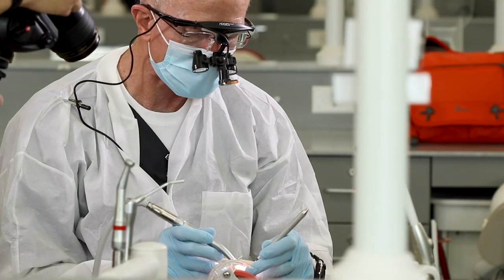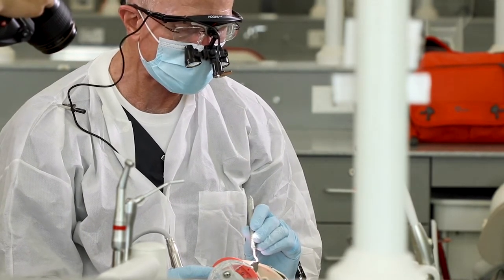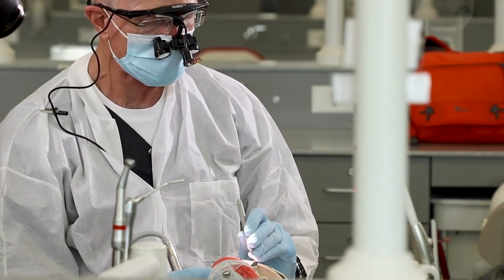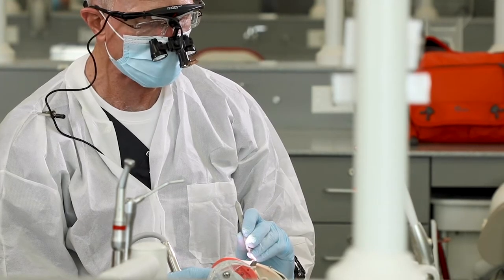This oblique ridge on these upper molars has quite a difference in height — there's quite a step down usually to get to that distal lingual cusp. We want to be a little careful not to over-reduce on the distal because we're trying to be conservative of our tooth structure. Getting closer now — I need to do a better job of mirroring the opposing occlusion. You can see where it's especially close near the mesial buccal cusp, so I'm going to take off a little more structure there to even that up.